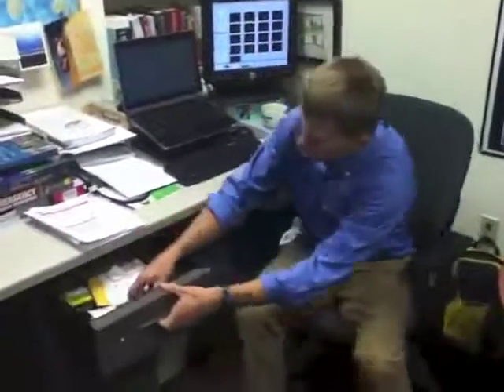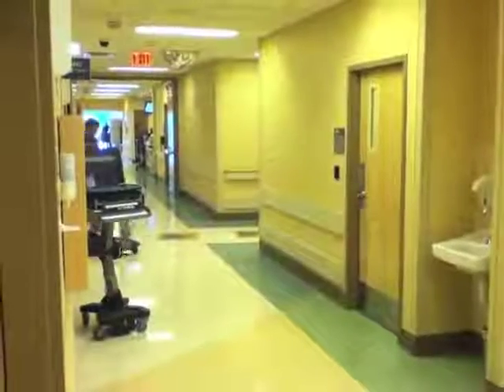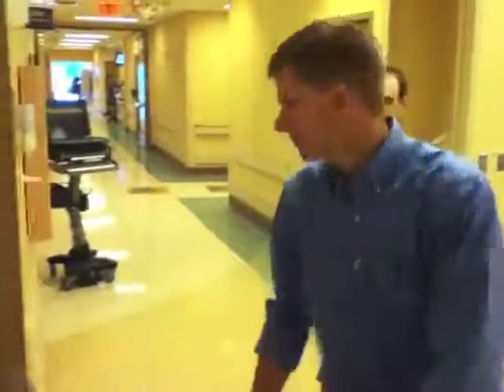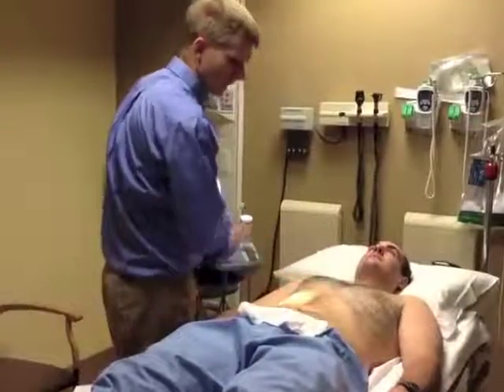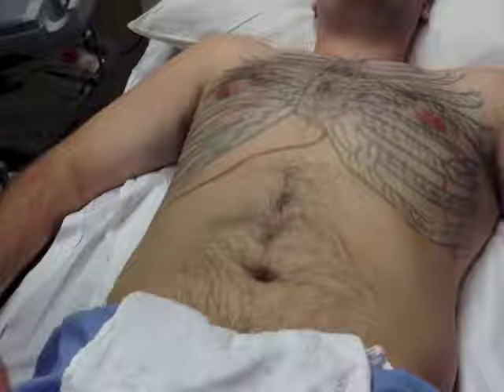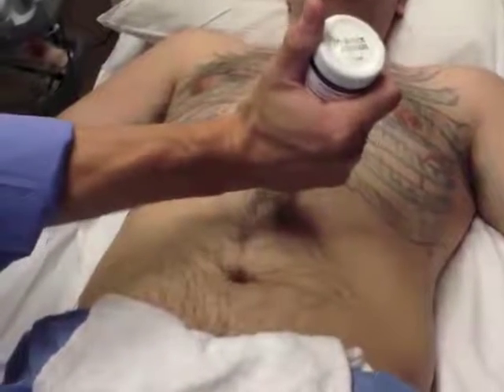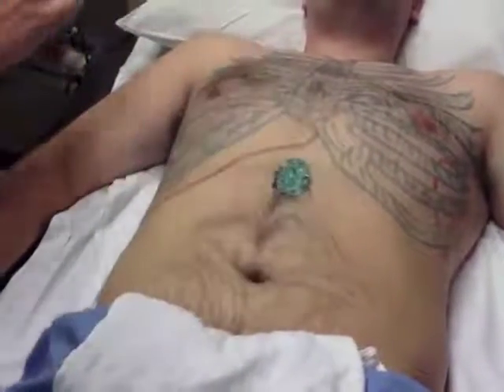Very good. You know, your timing couldn't be more perfect. Perfect for what? Come with me. All right, take off your shirt. Perfect. I've drawn some anatomically accurate thoracic anatomy on Felix Hegarty's chest to help illustrate important structures and relationships. To start, put a glob of gel on the epigastrum and grab the gel from here. This saves time.